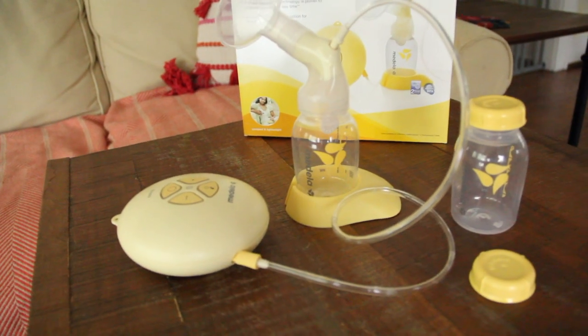Hi everyone, I'm Katie, a BabyList Scout, and today I'm going to give you all the details on the Medela Swing breast pump and show you how to use it along the way.